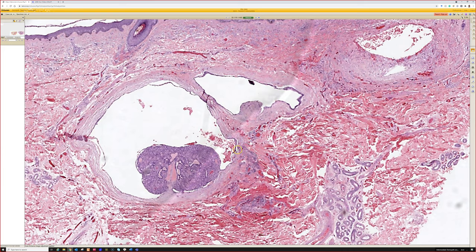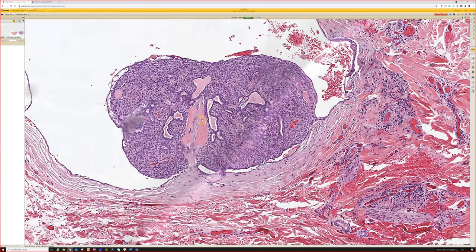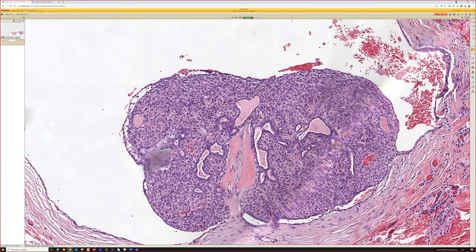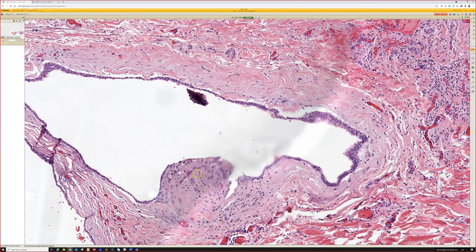Yeah, hidradenoma, very good. And it's sometimes called nodular and cystic hidradenoma, right? Because you tend to get lots of cystic spaces, and then you can have solid areas that form nodules. The ducts in hidradenoma can range from small little tubules like this that are lined by a little layer of cuboidal cells. Sometimes you can see kind of apocrine snouting. And then other areas, these are actually duct spaces, just big, huge dilated duct spaces that form these cysts.